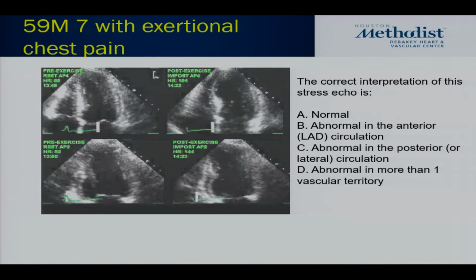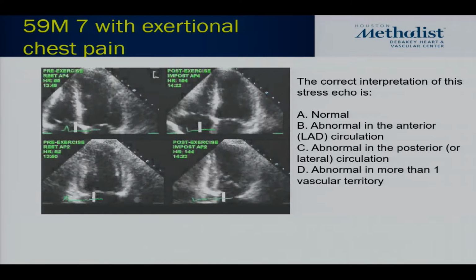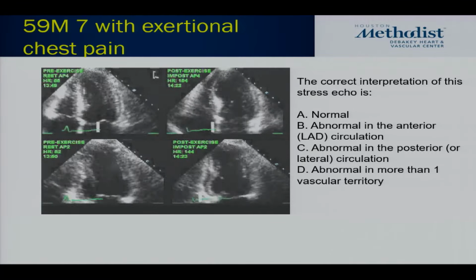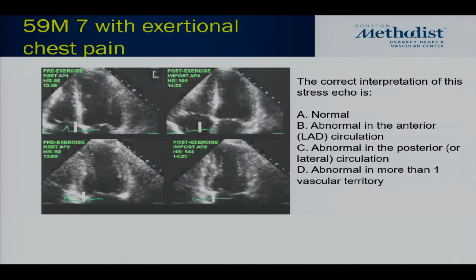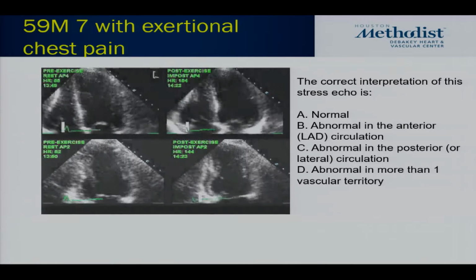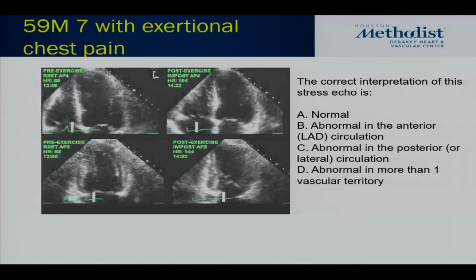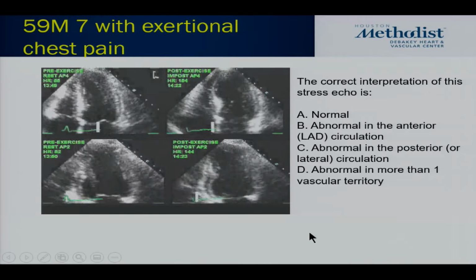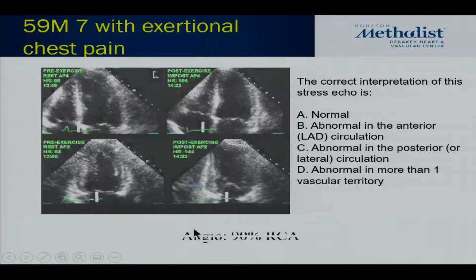Why? Because the left ventricular pressure is dropping, and the afterload is dropping. And one of the things that happens with ischemia is that the contraction, the tension building in the myocardium, is slowed down. So when the LV pressure is dropping, suddenly the afterload is dropping like crazy. And now the wall goes, oh, thank you, boom, and it thickens for a little bit. So you get this post-systolic thickening. That's one thing we try to catch, if we can, with the eye, or going frame by frame.